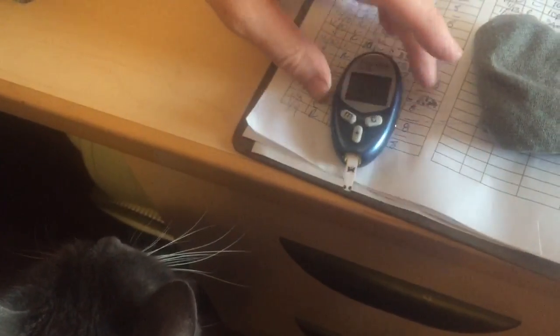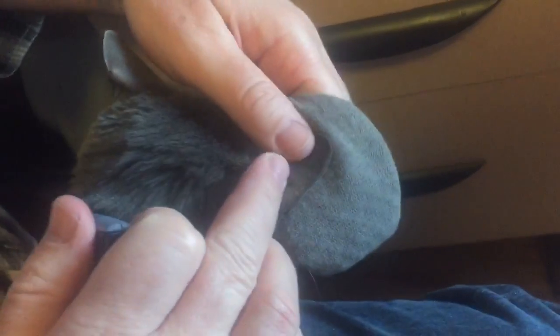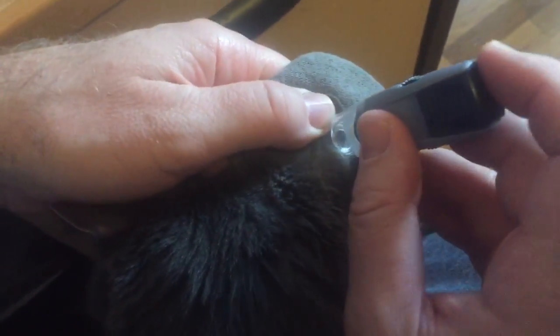You have to wait a second or two until it's ready. You can't wait too long or it shuts off. Then you grab your handy little sock. Kitty will just sit like this — he's very relaxed, he's done it a thousand times. You put the ear here.